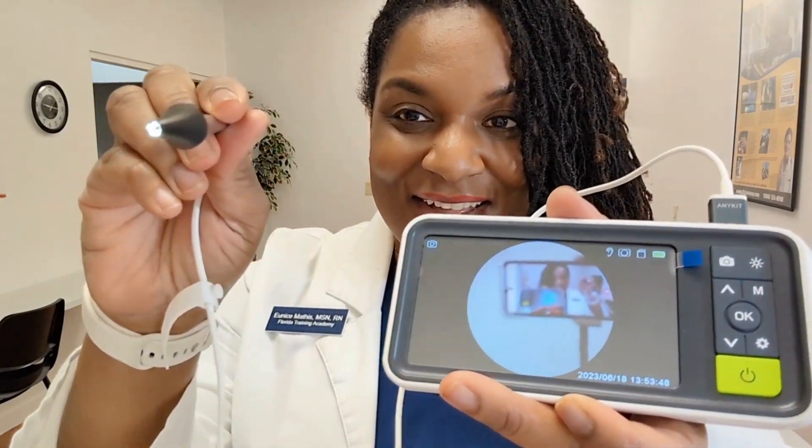You can already start seeing images from the camera as we get closer. What I want to do is actually insert this in my ear and adjust the lighting. I do that by pressing the lighting button.